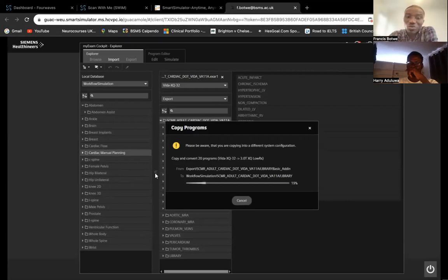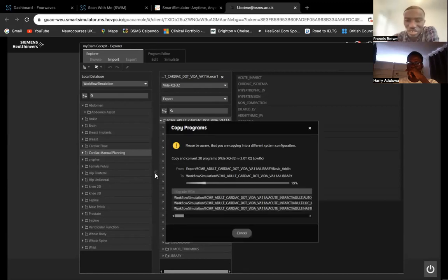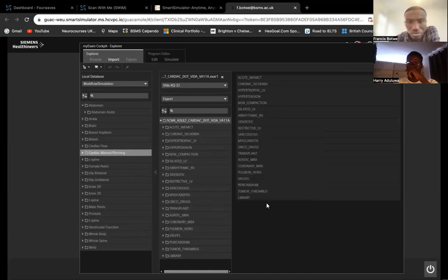This one will take about one hour, 30 minutes or something. So maybe we can skip this one. We can cancel it. So I think, Francis, they get the idea. We're going to set up the protocol for them. I mean, not protocol. We're going to download the sequences that they need for them to set up the protocol.